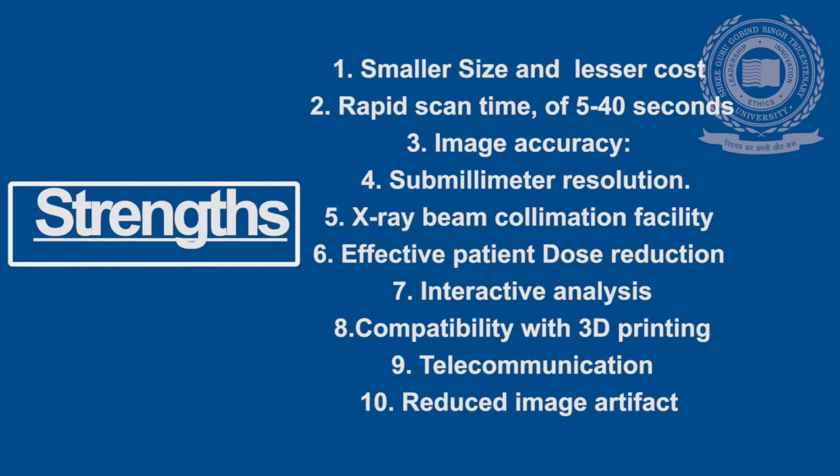Strengths of CBCT include smaller size and lesser cost compared to CT, rapid scan time of 5 to 40 seconds, image accuracy as CBCT machines provide isotropic voxels and undistorted images, sub-millimeter resolution, X-ray beam collimation facility allowing variable fields of view, effective patient dose reduction, interactive analysis, and compatibility with 3D printing.